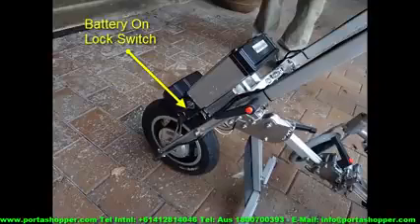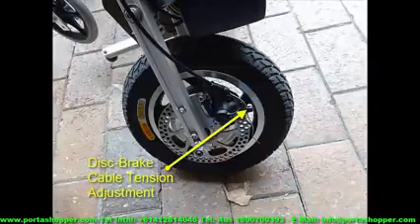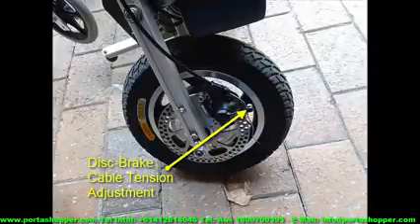To remove the battery, simply turn the key to unlock it, and you'll have to do this when you take it on an aeroplane. Lastly, even though your Porter Wheel comes with very powerful disc brakes, it's essential that you keep these adjusted at the right tension for the sake of safety.